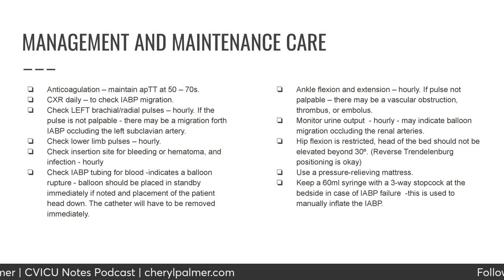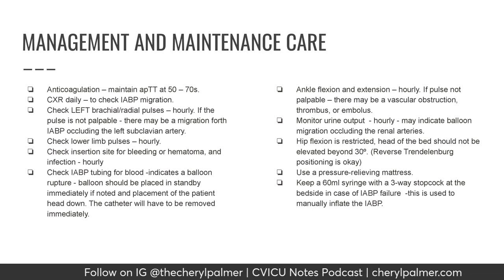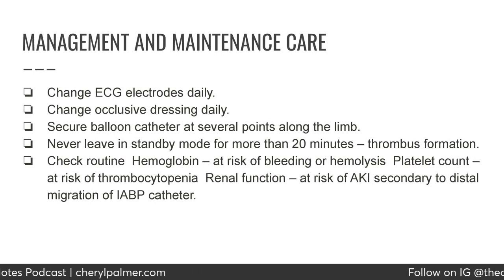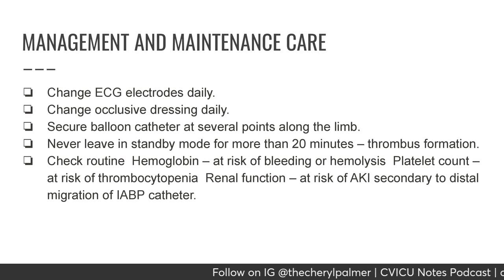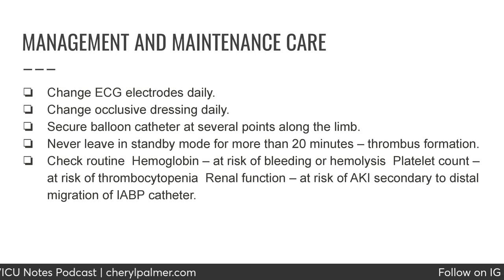Keep a 60 milliliter syringe with a three-way stopcock at the bedside in case of a balloon pump failure. This is used to manually inflate the balloon. You want to change your EKG electrodes daily, change the occlusive dressing daily, and secure the balloon catheter at several points along the limb. Never leave in the standby mode for more than 20 minutes. This may cause a thrombus formation if left in standby for longer.